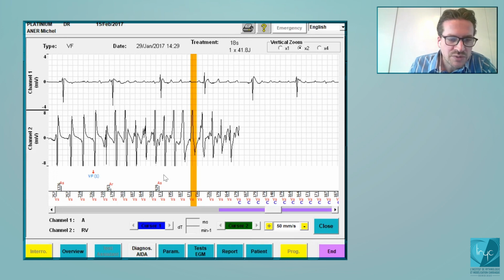This is this famous persistence. So this is the delay between the diagnosis of ventricular fibrillation and the delivery of the first therapy, being a shock. So this persistence is another counter, which starts with a 1 at the moment of the diagnosis, and then a bit similar to before, any cycles which are in that zone will increase the persistence of that zone.